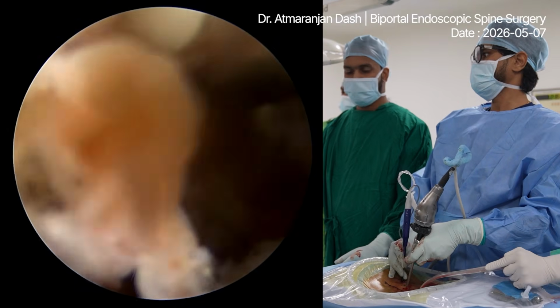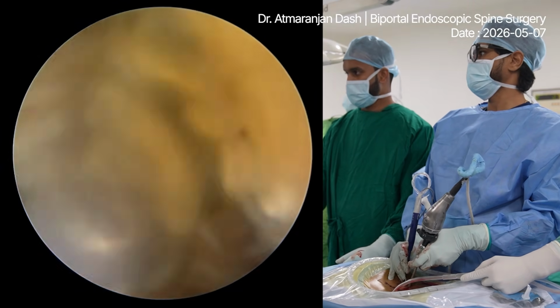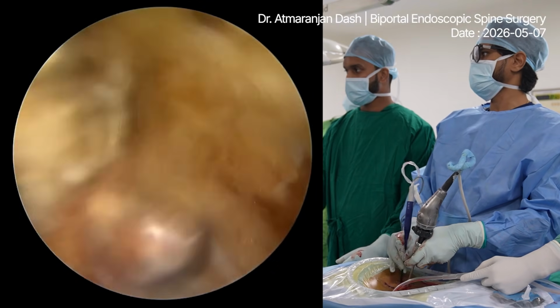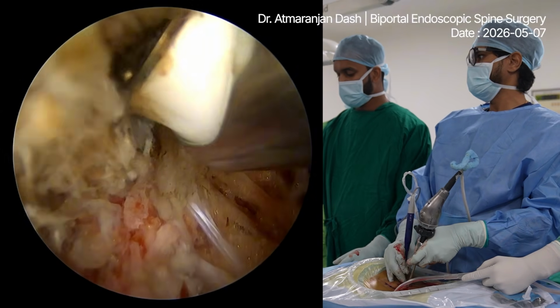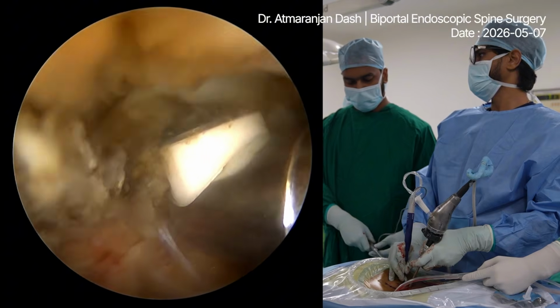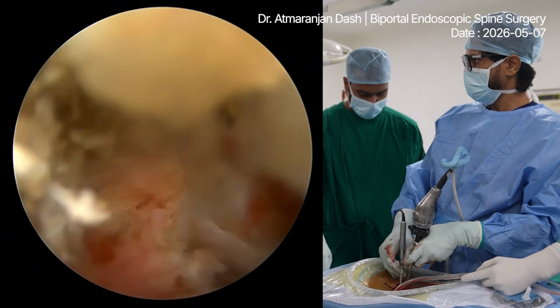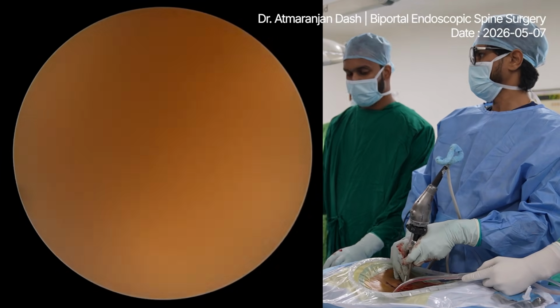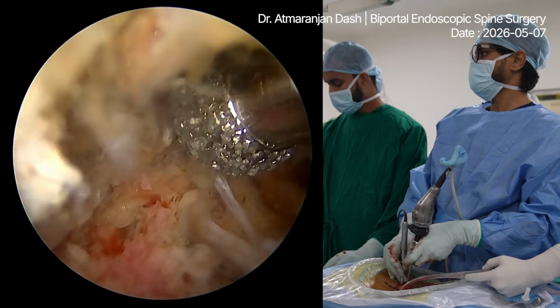Okay. Now we know the foramen is here, so we'll start working on it. So this is the foramen, and this is the mammillary process you can see here, and this is a broken TP. Stop. Drill. So you drill the foramen. So we started drilling the foramen here.